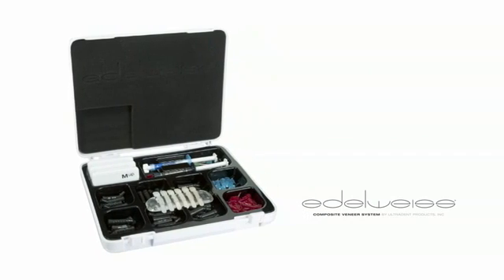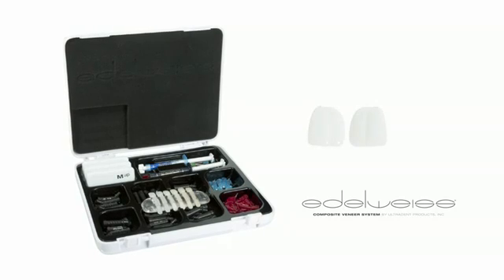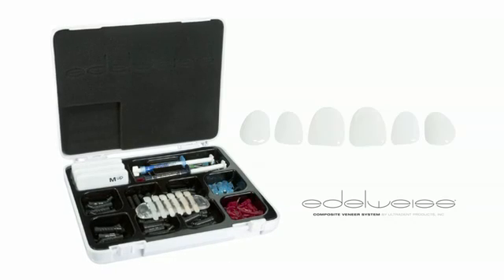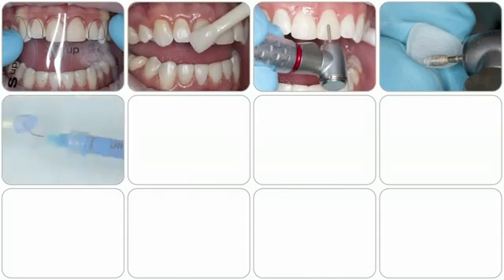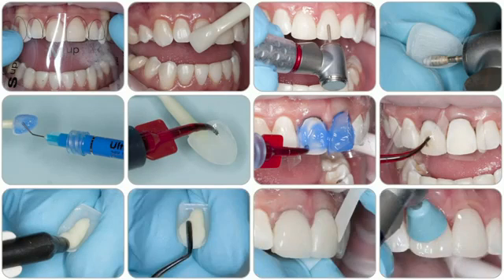Edelweiss is a prefabricated direct composite veneer system that utilizes Ultradense Amelogen Plus composite as the restorative material. This system allows the clinician to get the results of an indirect veneer at a fraction of the cost. This step-by-step video will demonstrate a composite veneer procedure using Ultradense minimally invasive techniques and the new Edelweiss composite veneer system.